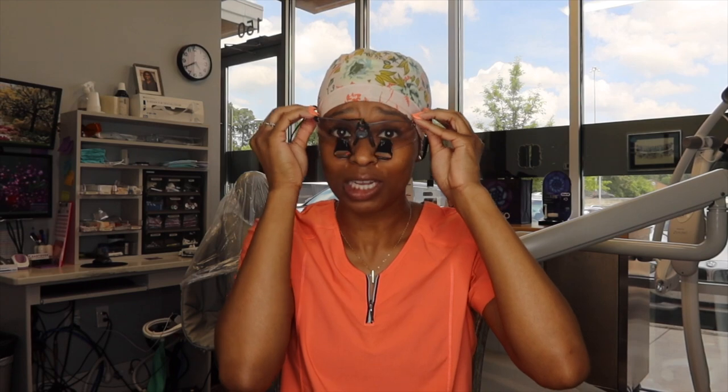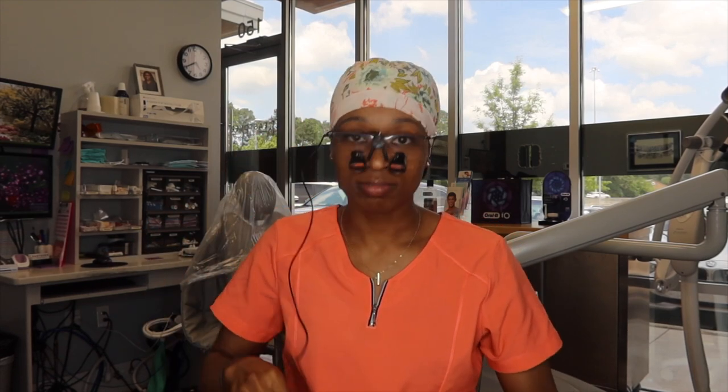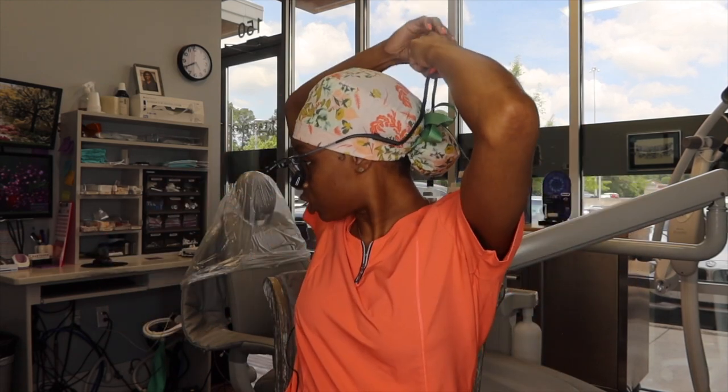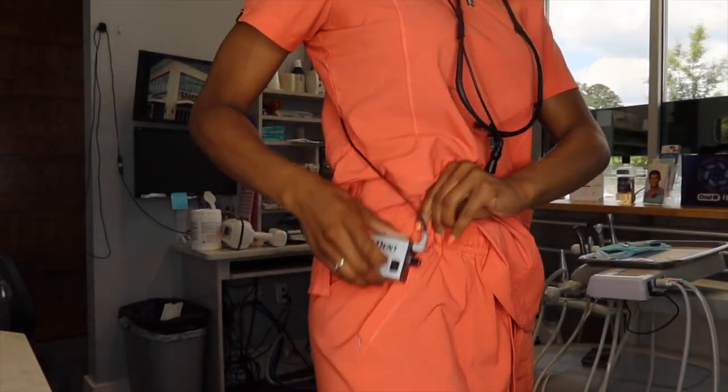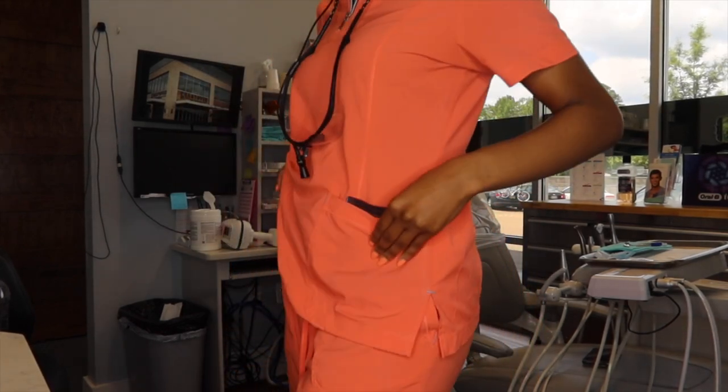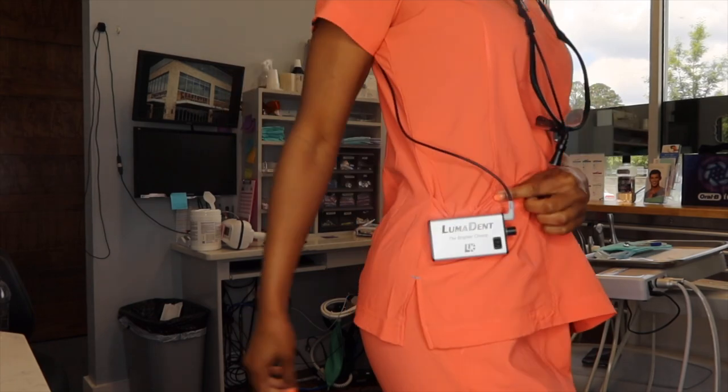Loupes are ideal to maintain good posture and ergonomics. I highly recommend loupes — I just haven't gotten around to buying new ones. Same thing, it has a string you can snap to the back of your shirt, throw behind your arm, and it has a drawstring you can tie as tight as you need. It also has a hook on the back to clip onto your scrub pocket. If you've never tried loupes, get some — it can help increase the longevity of your career as a dental hygienist.